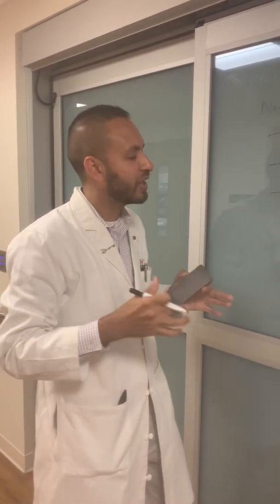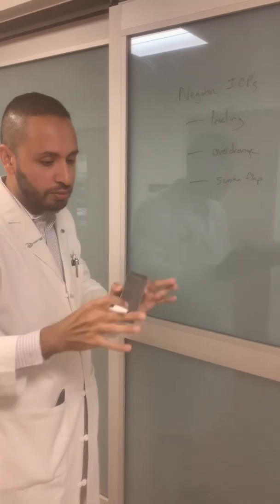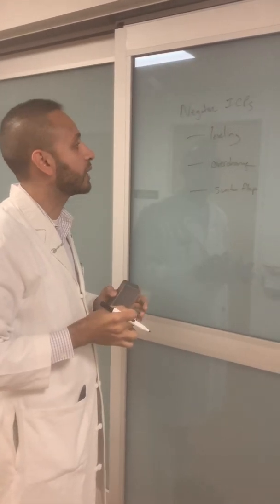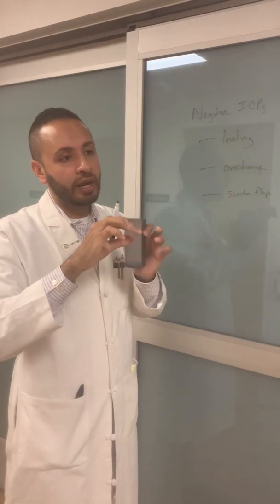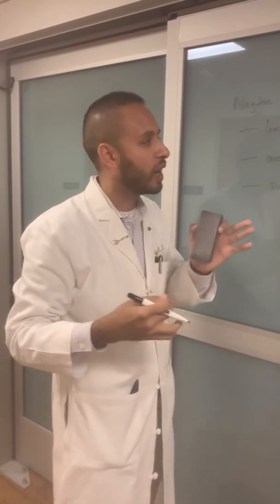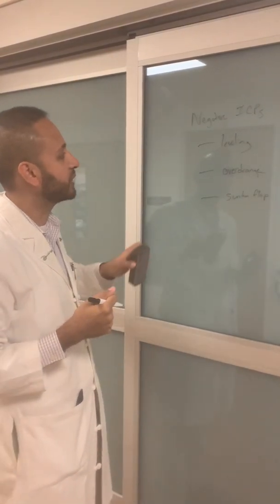All right, but I think for all practical purposes, really, looking at the actual EVD, the tubing, making sure it's level, is your transducer working right, make sure the plug is correct, all those sort of normal things you've got to look at. Now, very rarely you can have air in a certain area, and as you're draining it, it can create a negative ICP that way too, but most commonly I'm going to think about really where's your patient's level, right? That's going to be the most common cause for negative ICPs.